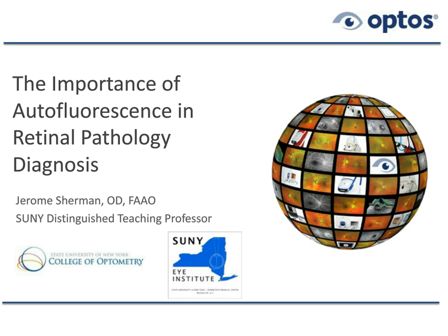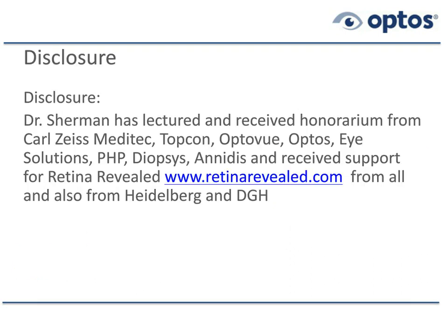So I think everybody knows the topic, the importance of autofluorescence in retinal diagnosis. And as far as disclosures go, I lecture pretty much for all the major companies that exist, and that includes Optos as well, and a lot of the OCT companies.